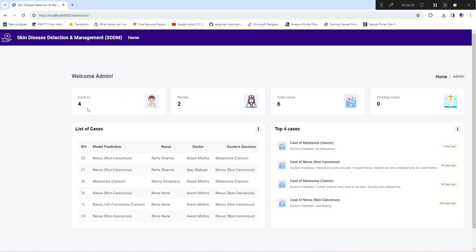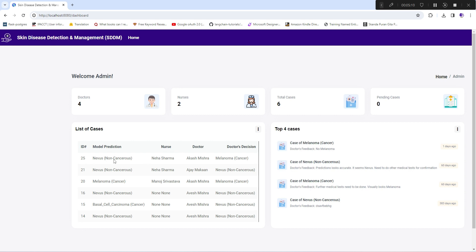Next is the dashboard — a very clean view showing how many doctors and nurses are available, total cases (which are dermatologic or skin disease cases), and how many pending cases exist. There is also a list of all reported cases showing the case ID, model prediction, which nurse handled the case, which doctor handled it, and the doctor's final decision. You can compare model prediction against the doctor's decision, and if the difference is greater than 20%, you can retrain your skin cancer model using those collected images.